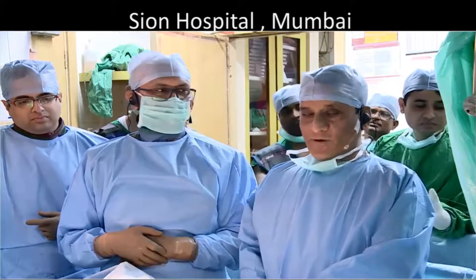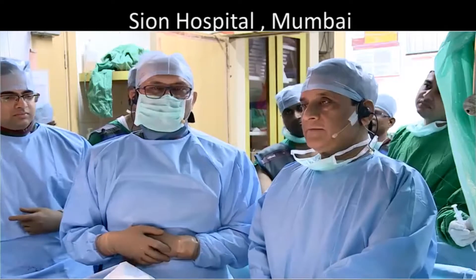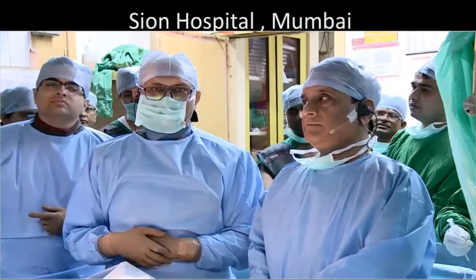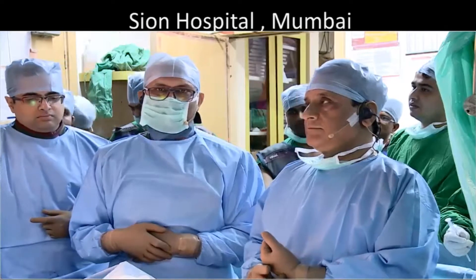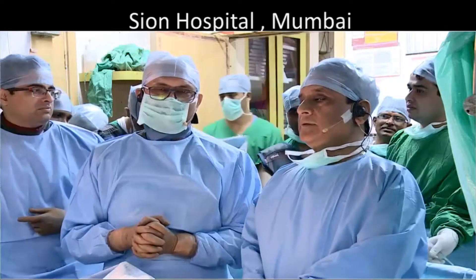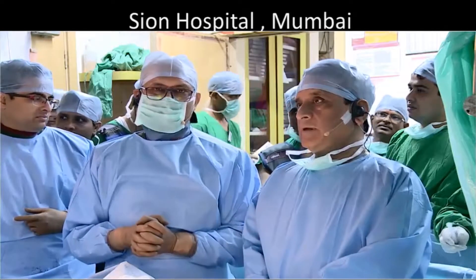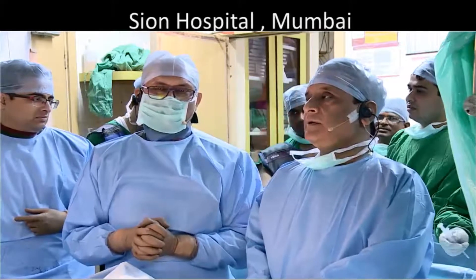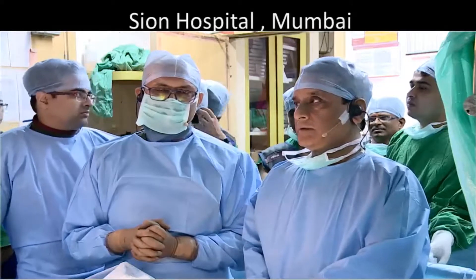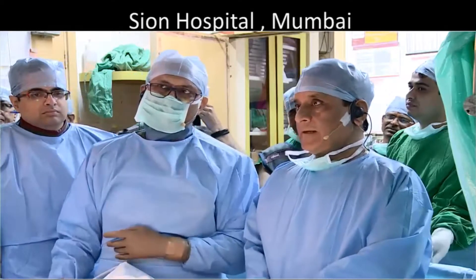This is a coronary case. Dr. Mahajan, tell a little history. He is a 58-year-old, known case of diabetes, chronic stable angina. He had rest angina on the 15th of July, some elevation of enzymes, and he was diagnosed with a non-ST elevation, anterior myocardial infarction. The coronary angio picture is in front of you.